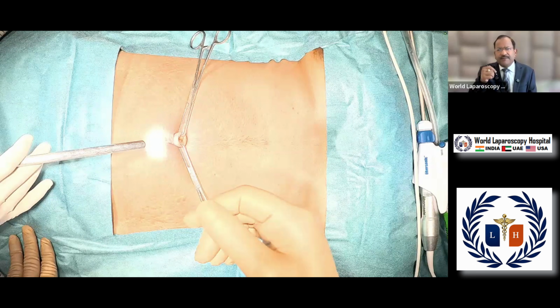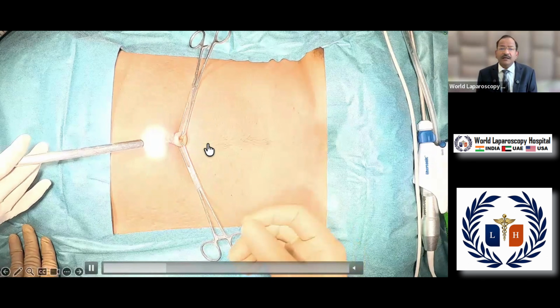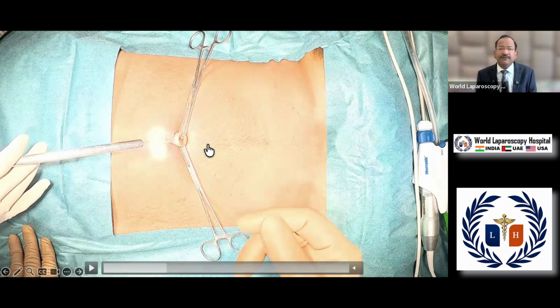Many people give a very big incision in the beginning itself, and when they put the gas, half of the gas is leaking outside, and your quadromanometric indicator like preset pressure, actual pressure, flow rate and total amount of gas used will not be giving you any idea where your gas is going. So, only give 2 millimeter stab wound with 11 number knife.